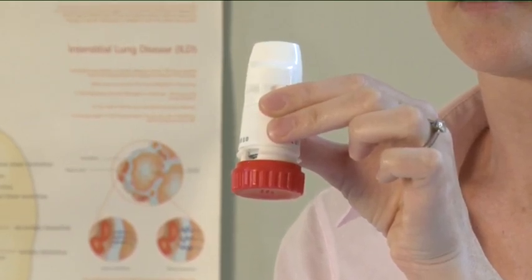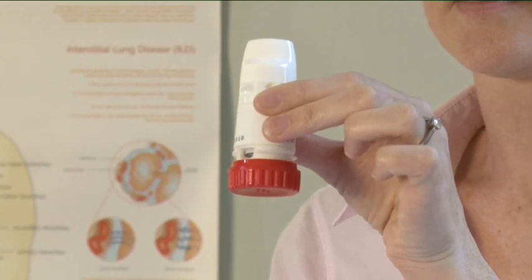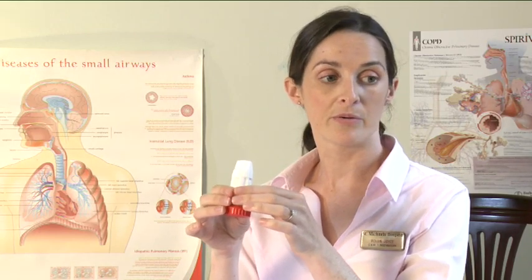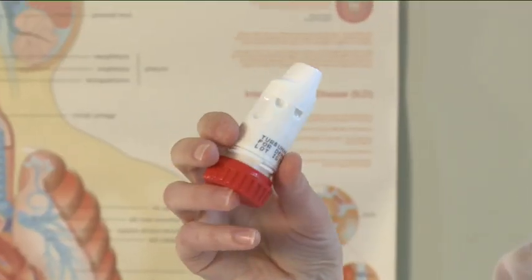You should hear a click. Your Turbohaler is now loaded and ready for use. Only load your Turbohaler when you need to use it. Hold your Turbohaler away from your mouth. Breathe out gently as far as it is comfortable. Do not breathe through your Turbohaler.